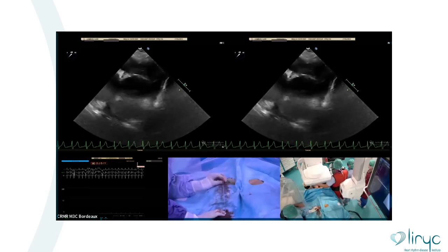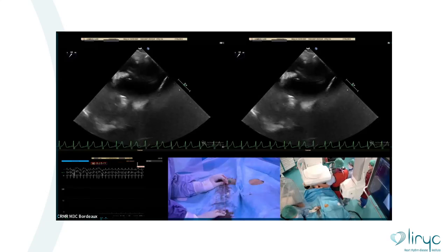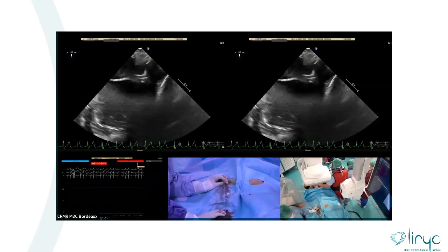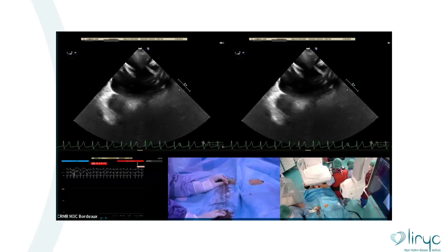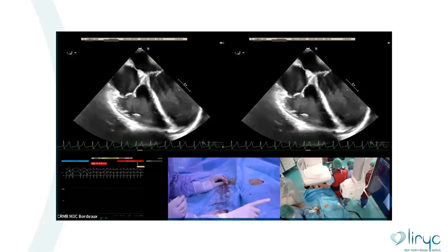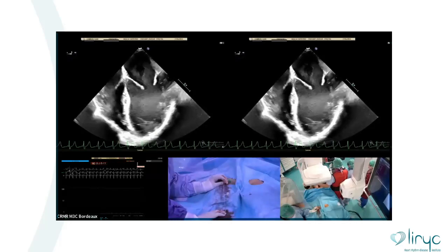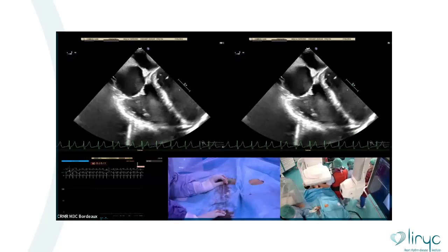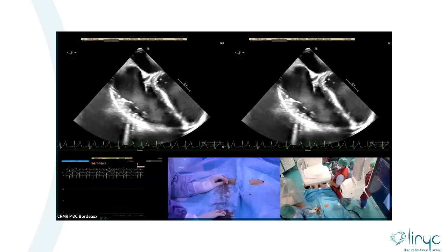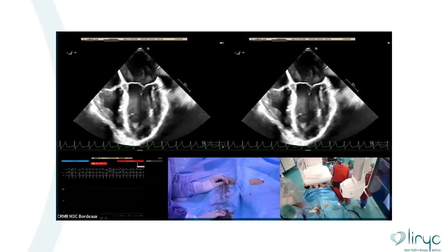Okay. So now we're gonna exchange, or maybe just to make sure, Olivier, can you show us the four chamber view to see whether the guide wire is in good position? Actually for the procedure, the good position is that we should locate the wire curve on the apex. It's not going up to the pulmonary artery. But anyway, if you go to the pulmonary artery, also no problem. We open it and pull back. Also can catch. While passing the sheath, maybe we're gonna fall down in the apex.